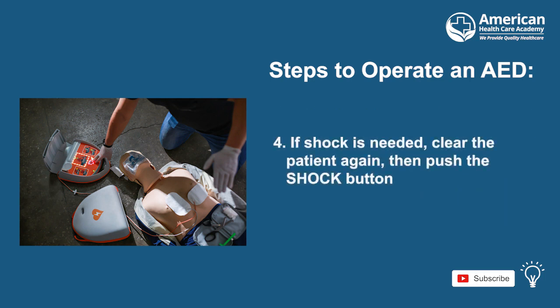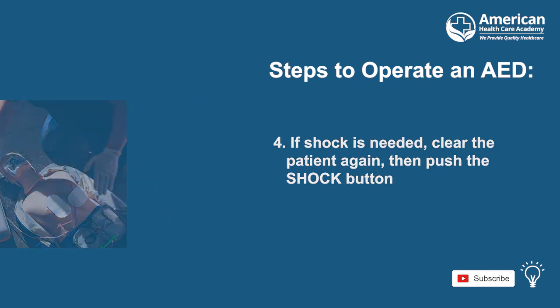Step 4. If shock is needed, clear the patient by making sure that no one is touching the patient, including the person administering shock, and then proceed to push the shock button.